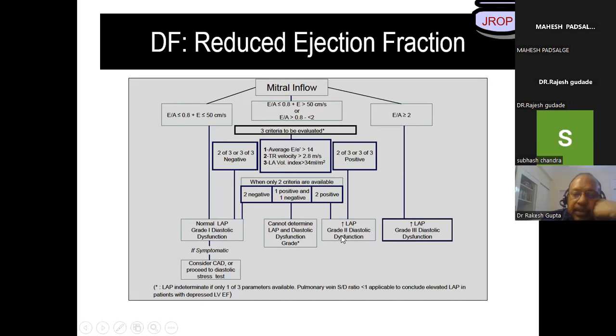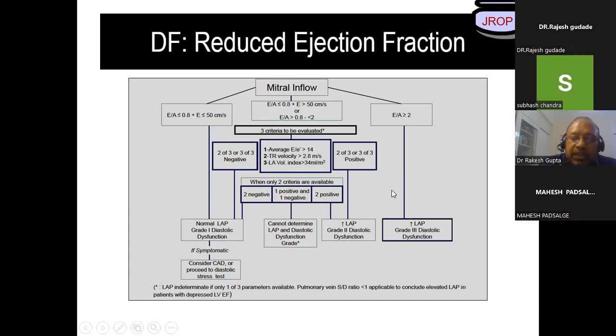Yes, sir. That's how we do this in regular subjects. So we have to identify LV function, and after identification of LV function, we look at whether it's normal or deranged, and then we classify them accordingly to various categories. Right? Yes, sir. Good. I hope everybody accepts this answer. Yes, sir. All right.